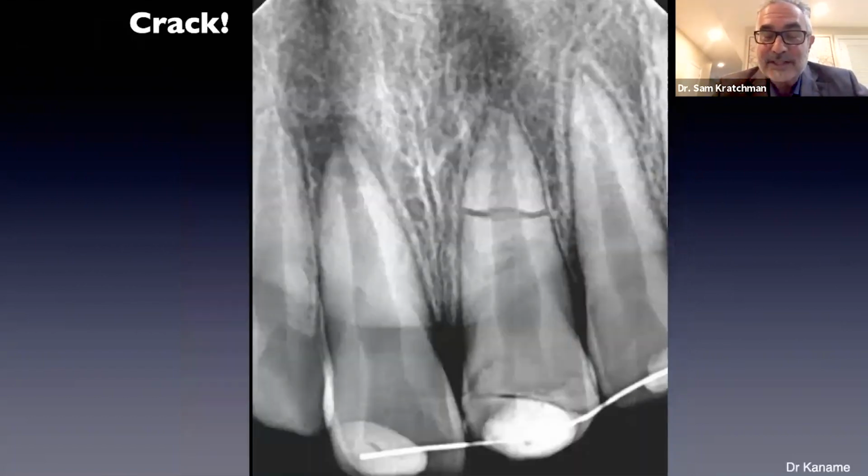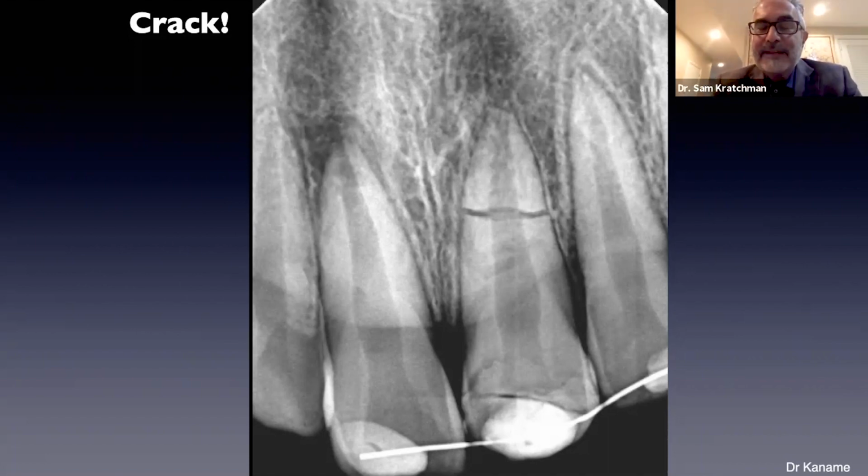Speaking of clean diagnosis, this is one of the clearest fractures I've ever seen. This was a young boy who did a face plant. Unfortunately, with kids, when they fall on their face, for some reason they smile and move their hands, and the first thing they do is whack their face. But from the periapical film, it looked like a horizontal fracture and it was splinted, which is the way to approach this.